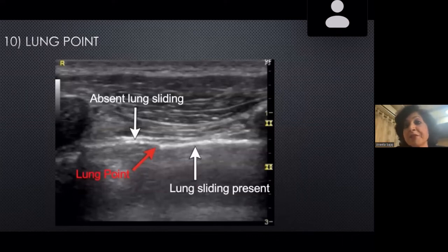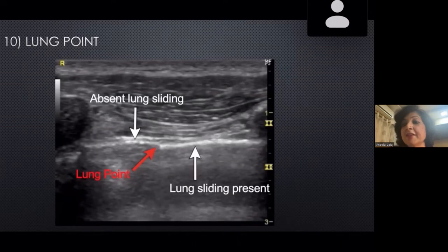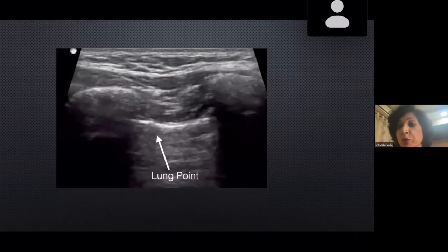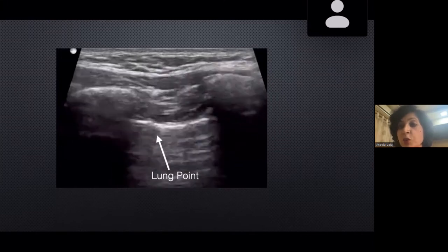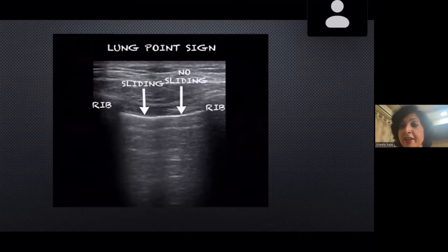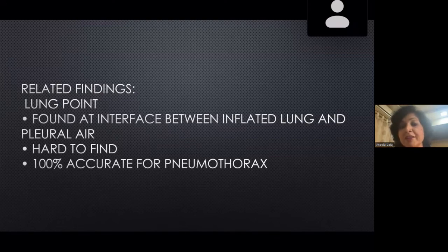One of the most important signs is the lung point — the interface between where the pneumothorax ends and normal lung begins. Finding the lung point is 100% diagnostic of pneumothorax. You can see a portion of the lung with good sliding and then a portion with no sliding — that is the lung point. It is a little hard to find but with good experience you can identify it. It is 100% accurate for pneumothorax.